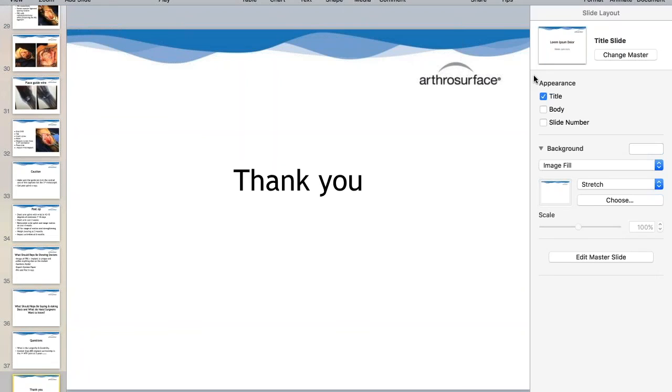So the key there is in the reaming. So if you're going to leave it proud, make sure you don't ream too much, so that you have that bony buttress underneath.